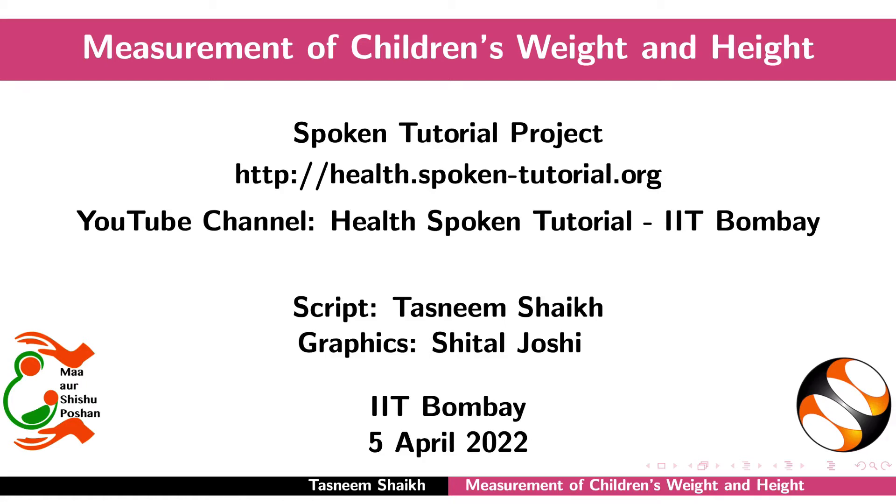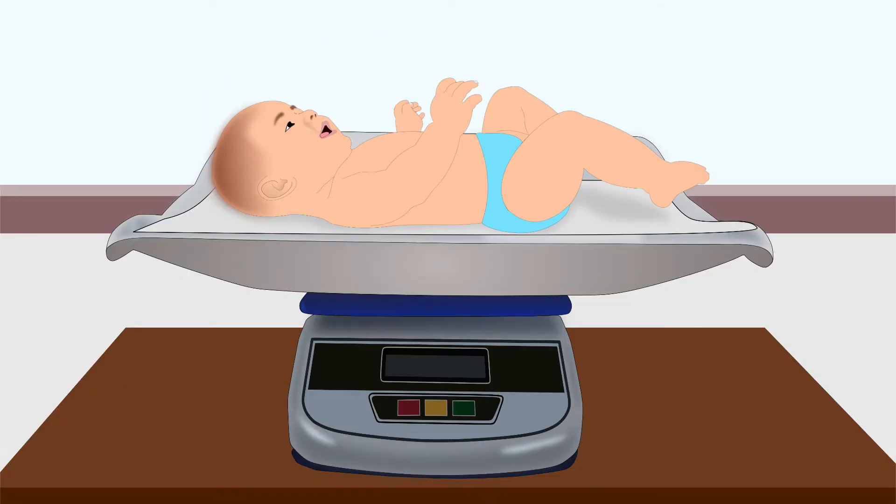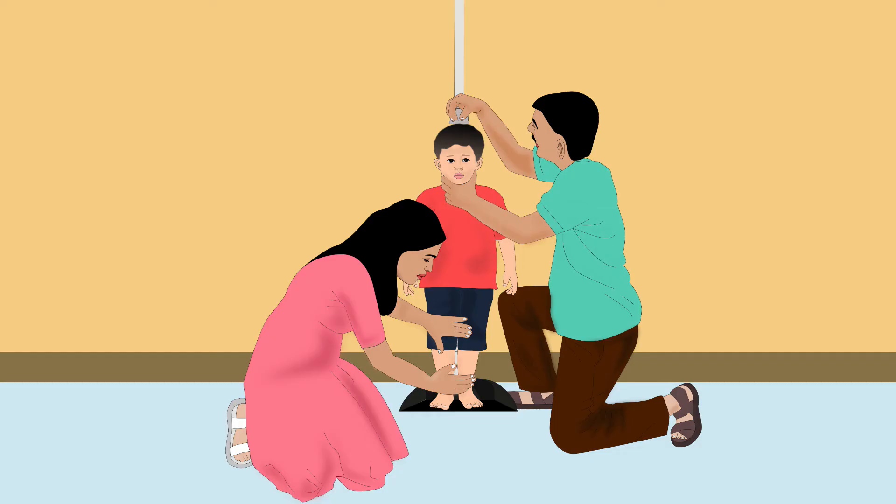Welcome to the spoken tutorial on the measurement of children's weight and height. In this tutorial, we will learn how to measure a child's weight using the Salter scale and the digital scale. We will also learn to measure his length or height.